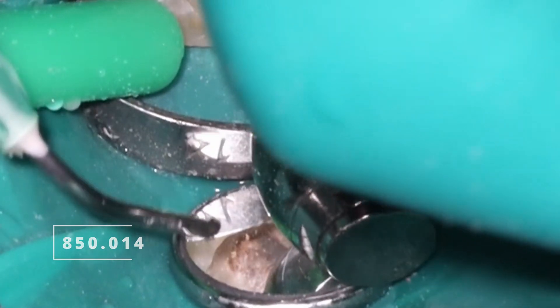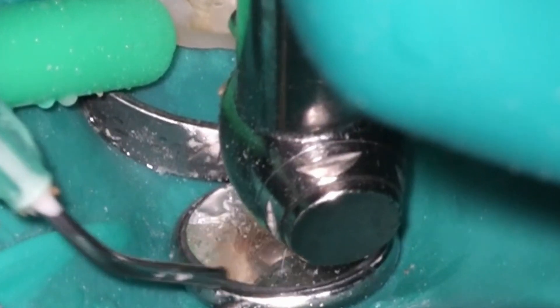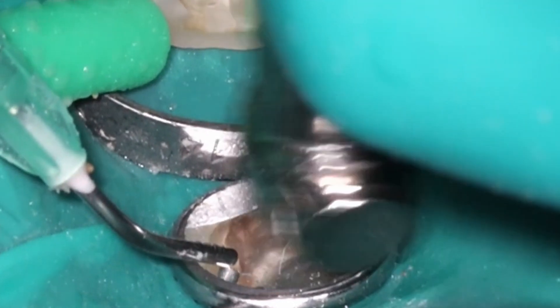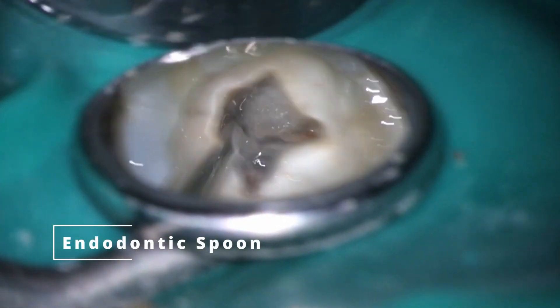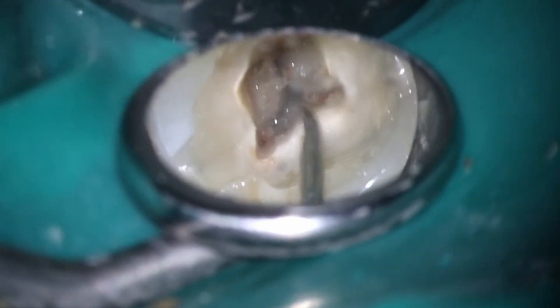And then almost that calcification — the reactive reparative dentin that you see down inside there — you need to clean that out to make sure you have access to all of the canals. In this case it's a four-canal tooth. I'm very pleased with how the x-ray ended up looking on this one. I was able to get things nice and small. Little pulp stones there too — got to use that spoon to pop those out to get all that nastiness out as well.